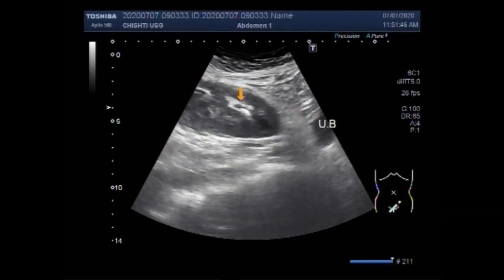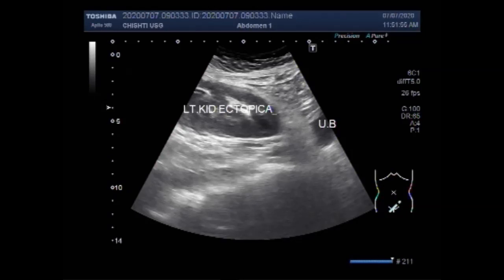This is the urinary bladder. This is the ectopically placed kidney. A stone is also seen in the upper one third of the ureter of this ectopically placed kidney.